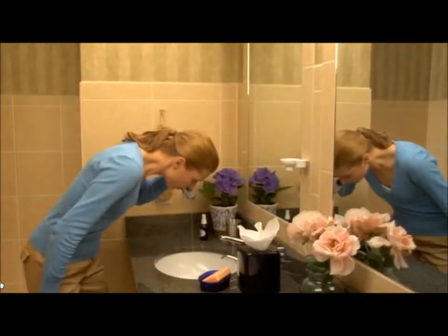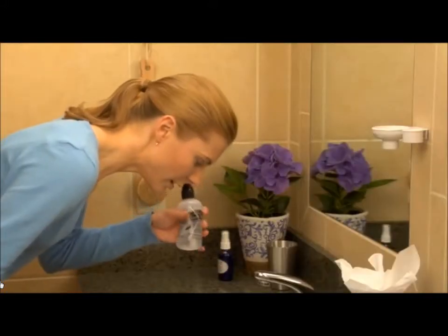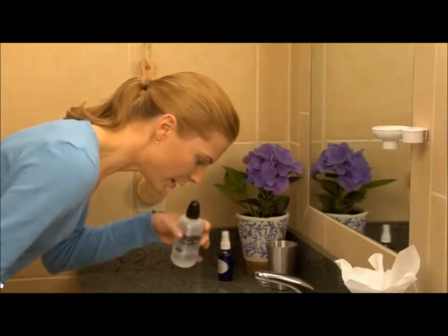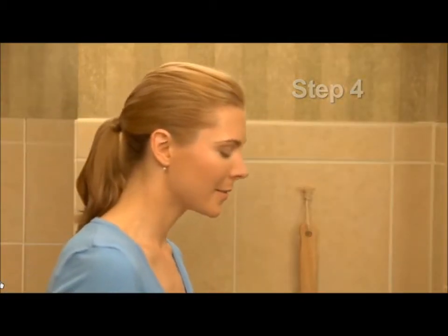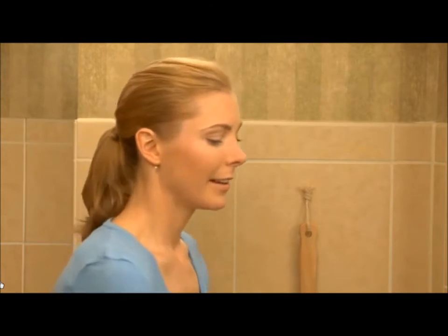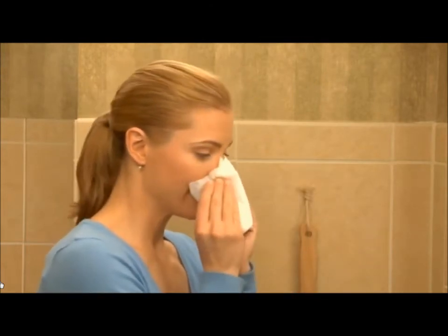Gently squeeze the bottle until the solution starts draining from the opposite nostril or from your mouth. Keep rinsing until at least one quarter to one half of the bottle is used for a thorough wash. Do not swallow the solution. If tolerable, sniff in any leftover solution remaining in the nasal passage once or twice before blowing the nose, because this could clean out the back airway.